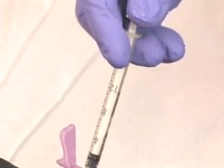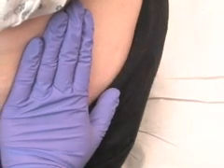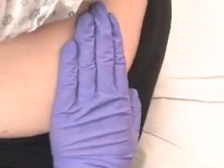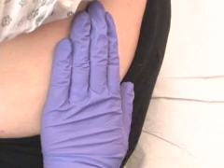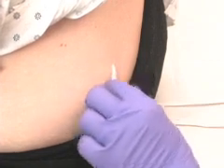Wait for 10 seconds. After 10 seconds, quickly withdraw the needle and allow the skin to track back over the original injection site. This allows the subcutaneous tissue to cover the muscular injection site. Blot the area gently with an alcohol wipe.